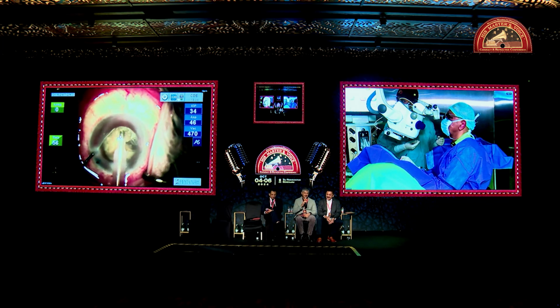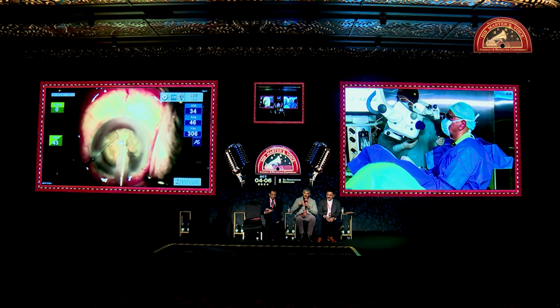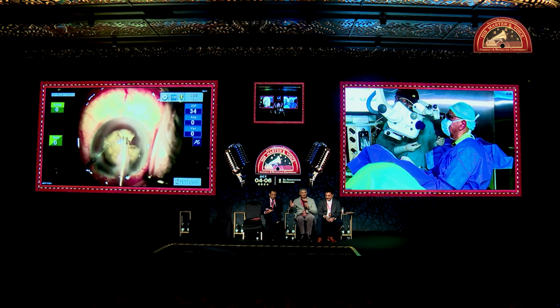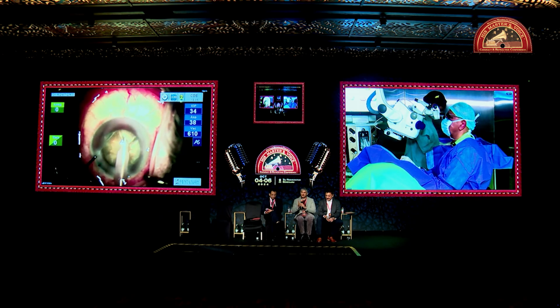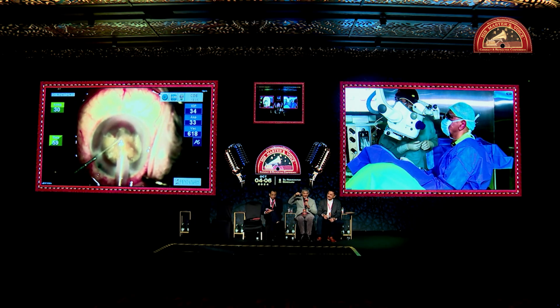See, for beginners, it's quite safe to use. The other thing is, when you're chopping, every hard cataract has a sweet spot. It's just like when you hit a 6 in cricket, or when you hit 200 yards in golf, you can actually feel that. There's a sweet spot in the bat, and it will go for a 6. Similarly, the nucleus has a sweet spot, which is slightly deeper than the center.